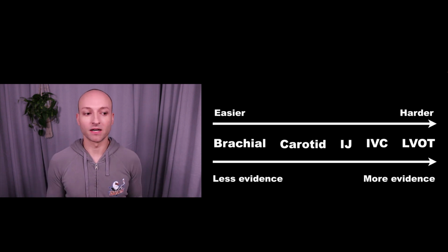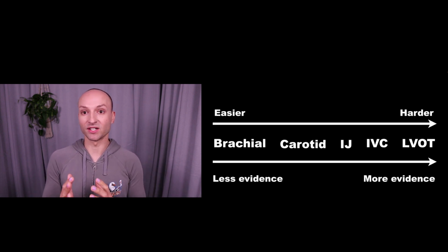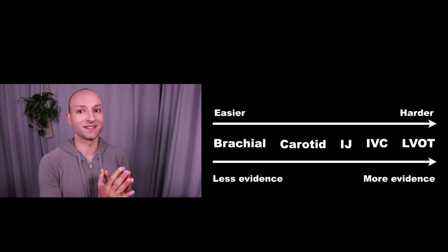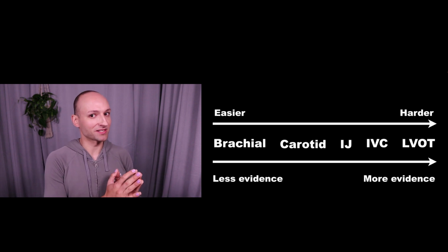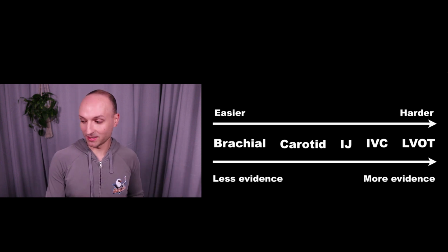And then probably the most studied one, the one that we're most comfortable with, is going to be looking at the LVOT. Now with these, it's not fair, but I feel like the harder it gets to actually get a good view of it and to actually use it, the more evidence there is. And the ones that should be really easy, and are actually really easy, have a little bit less evidence.